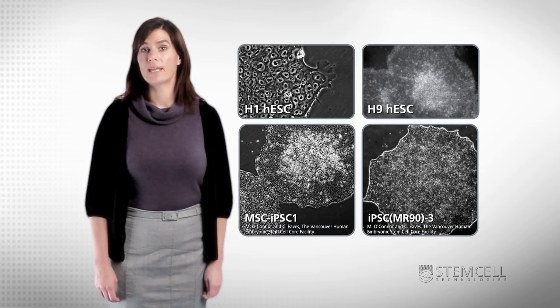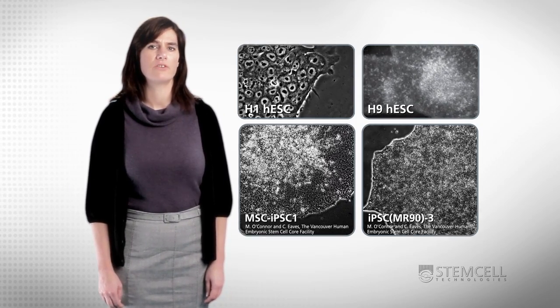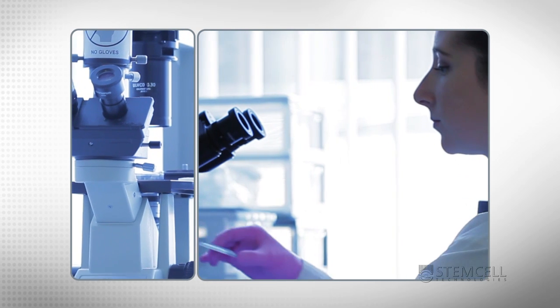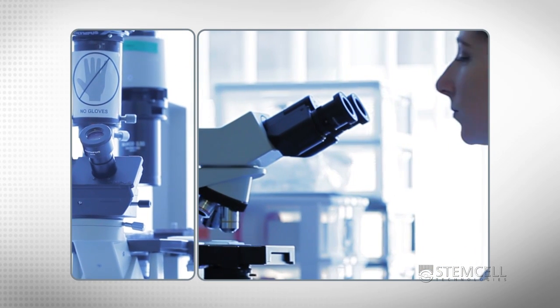Routine culture of human embryonic and induced pluripotent stem cells presents some unique challenges when compared to the culture of other adherent cells. Colony morphology is usually used to monitor the health of these cultures. For this reason, cultures should be examined daily using a microscope to monitor the quality of the cells and to check whether they are ready to be passaged.